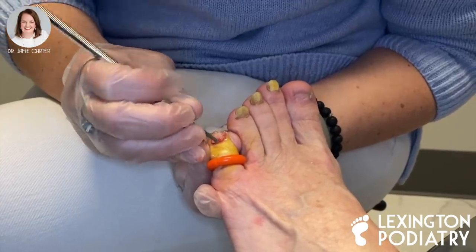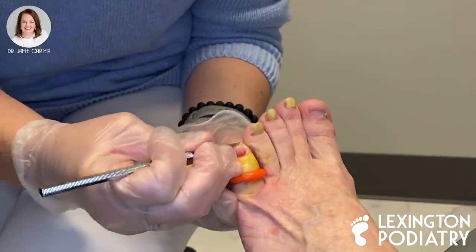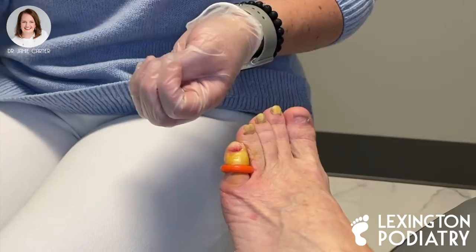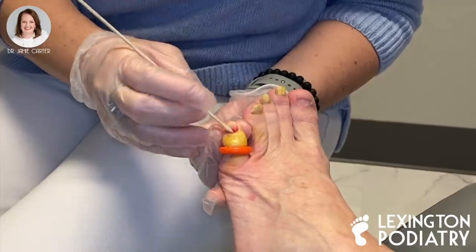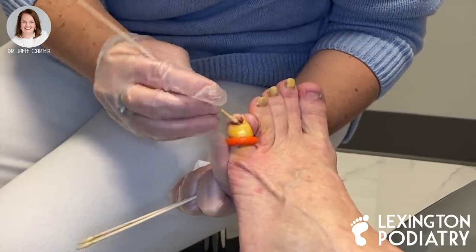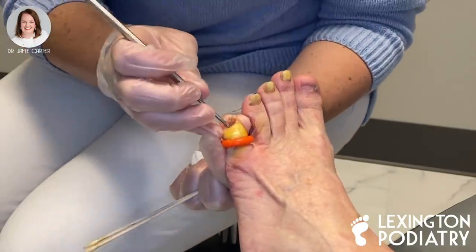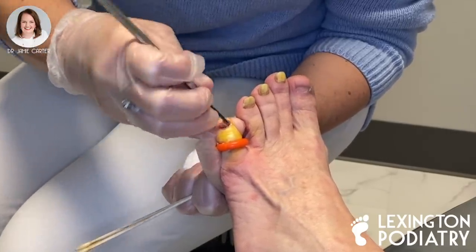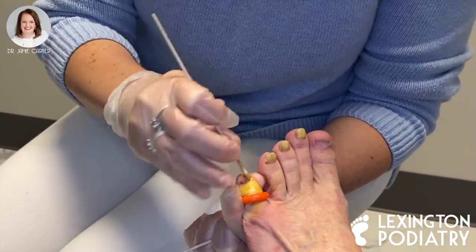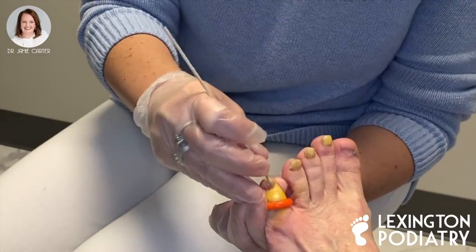If we weren't going to do a permanent procedure on this, it would grow back and look just the same way that it did. So it's a really good thing that we're going to put chemical on here and be done with this toenail. We use sodium hydroxide here in our office — I've used phenol before as well — and I find that the sodium hydroxide gives me a less reaction, so it's less painful, less irritating, and I think it heals up a lot quicker. I'm going to scratch that nail bed just a little bit. The black discoloration you get is when you put a chemical and it mixes with any blood at all, so it doesn't mean your toe is going to rot off. Three applications of the chemical and then we will neutralize it with vinegar — that helps to get it off your skin and make sure that we don't get any blistering.